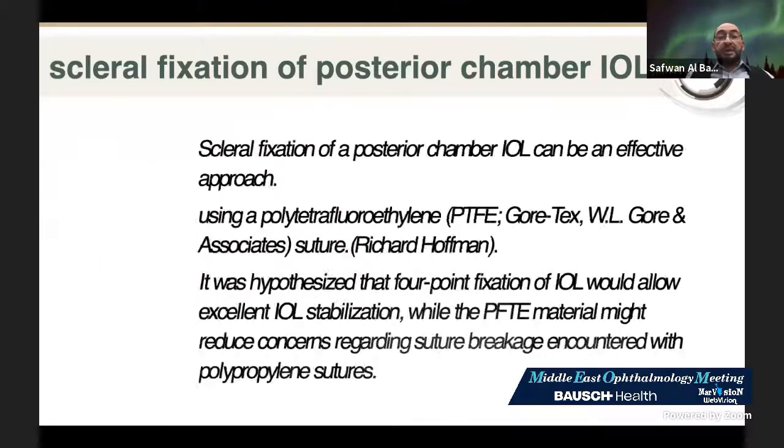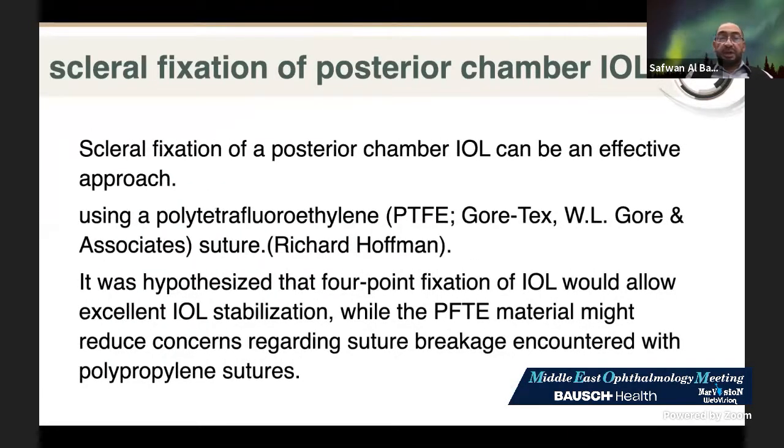Scleral fixation of a posterior chamber IOL can be an effective approach using polytetrafluoroethylene, as Dr. Carlos mentioned, which is the Gore-Tex. I searched for who first used this suture off-label, and the first to publish on it was Professor Richard Hoffman.